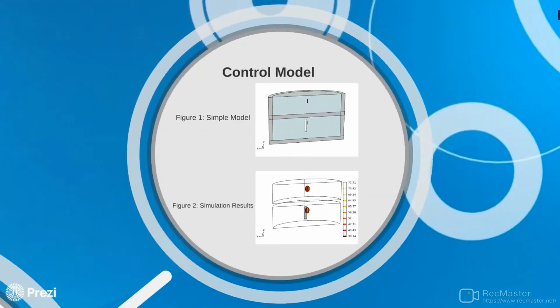To get a better understanding of this procedure within non-homogeneous tissue, a control model of sorts was built. Within this control model, there are two test cases. The first is the muscle-only case present in the top half portion of the model. The second is a bone cylinder case, which is present in the bottom half portion of the model.